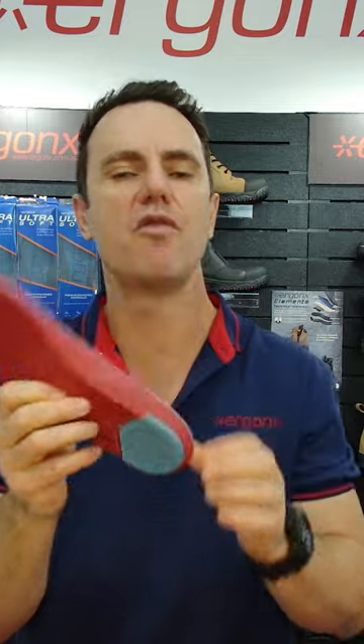So this orthotic inner sole will actually cushion your foot but give you very minimal arch support, and believe it or not, not everyone can tolerate an arch support. So this is a great alternative for people that want extra cushioning and want that really nice premium feel to their shoes without any arch support.